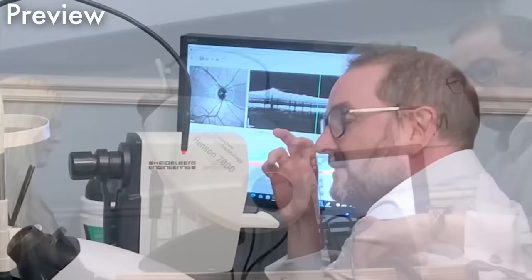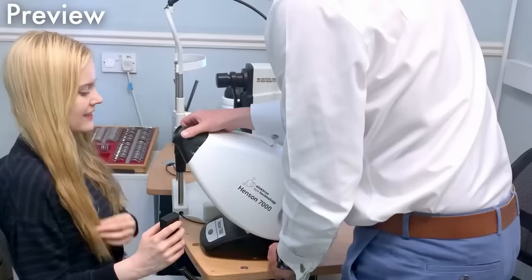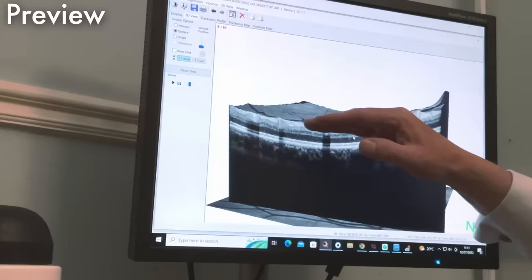So this is the button here. Okay. That's there. And I can move this up and down. So you need to put your right eye in there first. Yeah. And then close your left eye. And you can use your finger just to hold your lid if you want, whatever's more comfortable. And you see there's a dot in the middle there. Yep. So this is the layers of your retina.